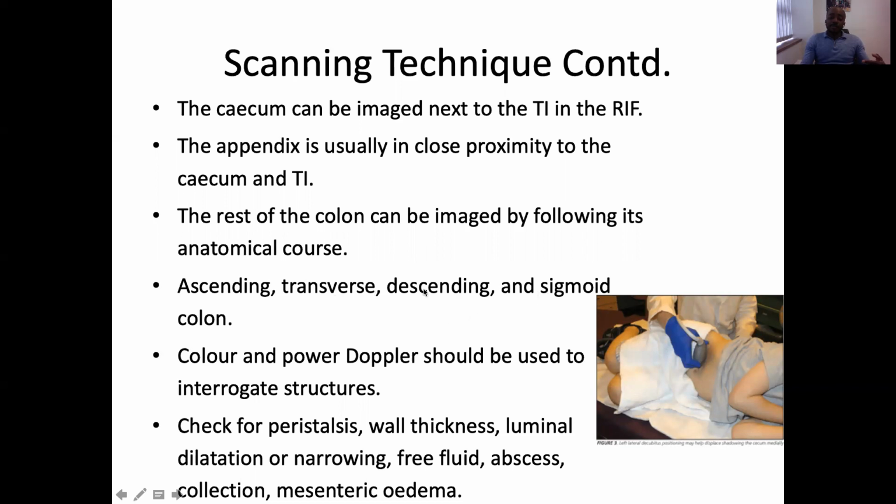And quite a lot of literature that I have encountered, and some textbooks as well, and even conferences where renowned gastroenterologists who have written lots of books on bowel ultrasound delivered lectures, expressed the consensus that they also scan the bowel in reverse from the sigmoid colon. They find it easier and more organized to do so. So it's kind of from the sigmoid colon all the way back.